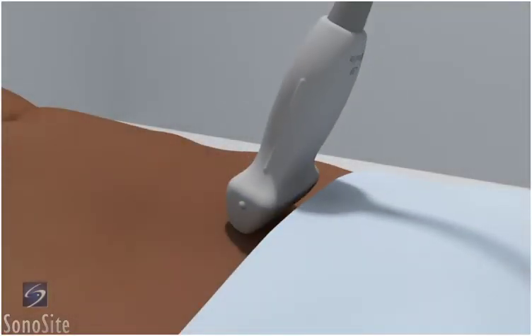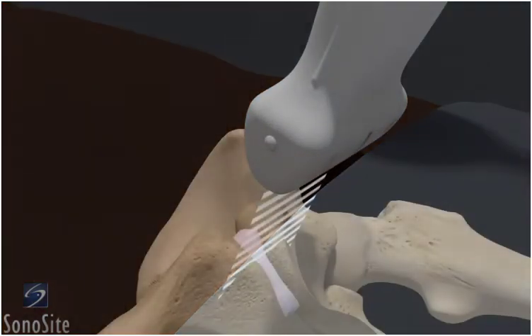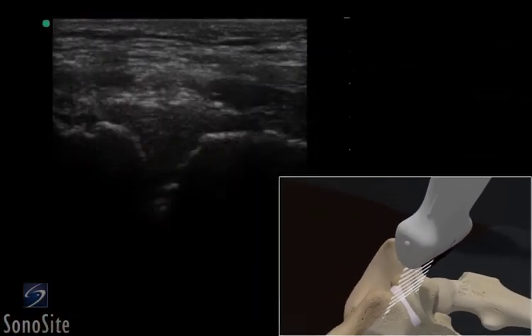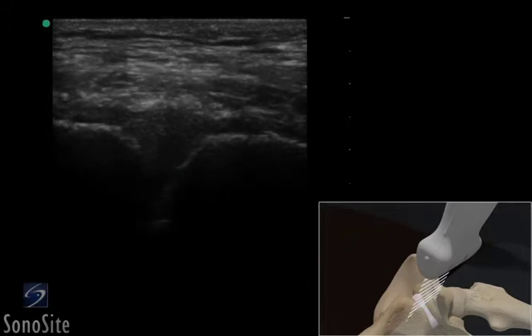The transducer is placed longitudinally over the pubic prominence with the orientation marker directed to the patient's right. The right and left pubic bodies are seen as bright, hyperechoic curved structures. The pubic symphysis is seen as a darker, hypoechoic line between the two bodies.